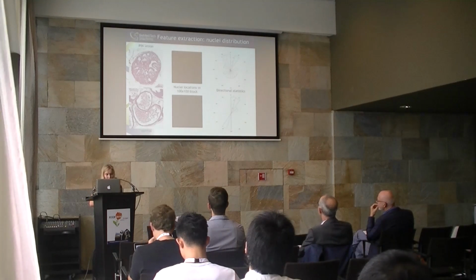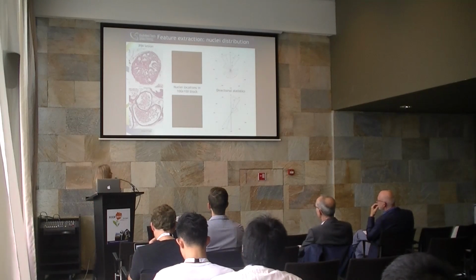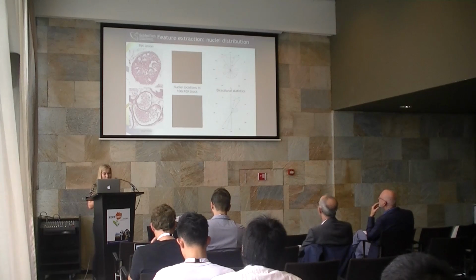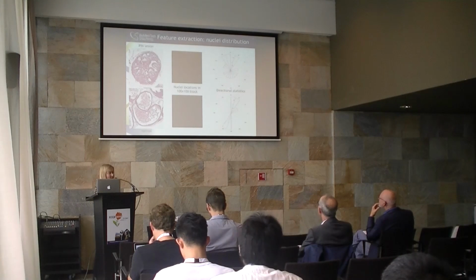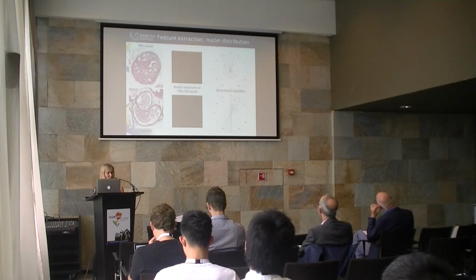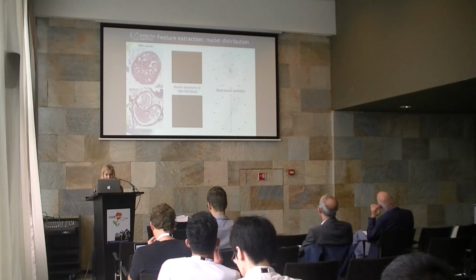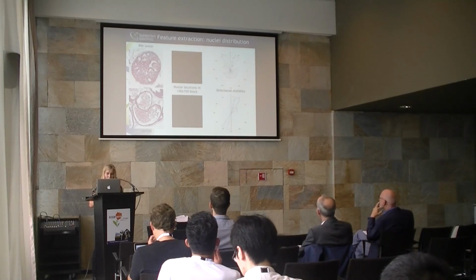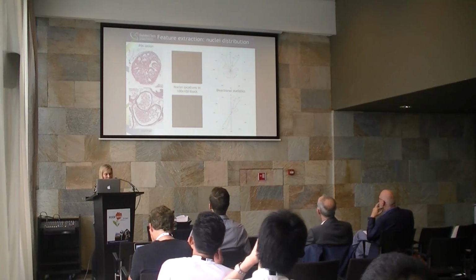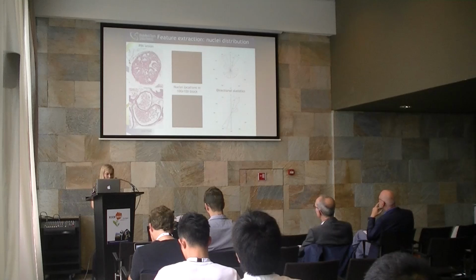These features were extracted from a bit bigger neighborhood, which has the nuclei locations marked. Maybe you can see them, but we calculated, for example, distance features and directional statistics from these. So, for example, the angles between the center nuclei and the other nuclei, and you can see those angles in the polar plot. When you look at this angular histogram, the difference in the arrangement of the nuclei between PIN lesion and normal tissue is quite visible.